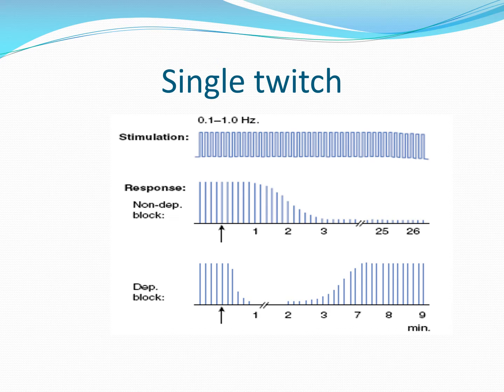The third diagram, the black arrow denotes the administration of the depolarizing blocker succinylcholine. You see the rapid response to the muscle relaxant here in contrast to the non-depolarizing block, and the rapid reappearance of the twitch height in a few minutes.